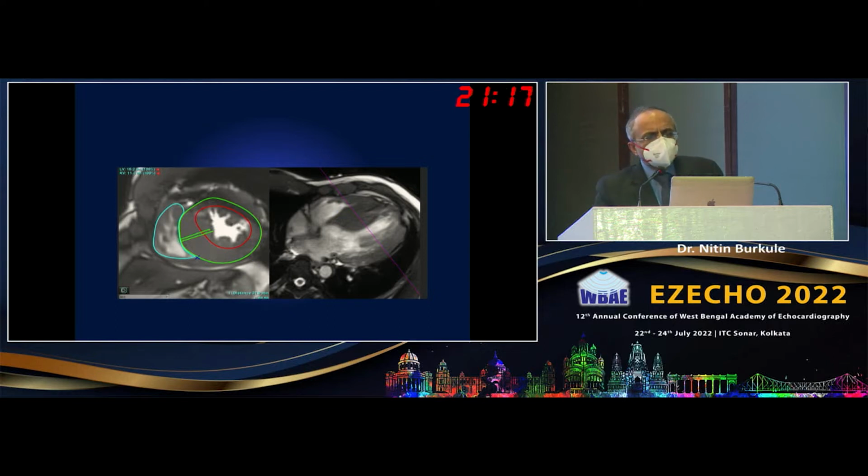So the clinical point is that the moment you see a thickness of 25 millimeters or around that in the echo, be sure that you can still be at 30 millimeters somewhere, because you have got a 5 millimeter variability. And in the MRI, if you are reaching this region of 27, 28, again get alerted, because as you know, 30 millimeters and crossing that has a very high incidence of sudden cardiac death, and it need not be the septum, it can be any focal territory.